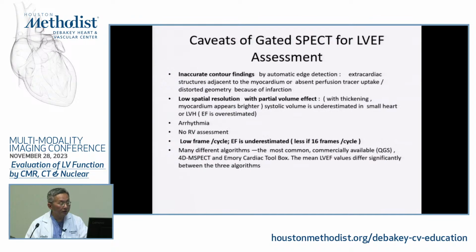So, what are the caveats, okay? The key here is we're detecting the wall, right? So if the patient has a huge transmural myocardial infarction, no counts, sometimes you won't be able to localize. For instance, the patient with apical aneurysm, sometimes it's hard. Or you can have extra cardiac activity, okay? And the second disadvantage is really, SPECT has really poor spatial resolution.